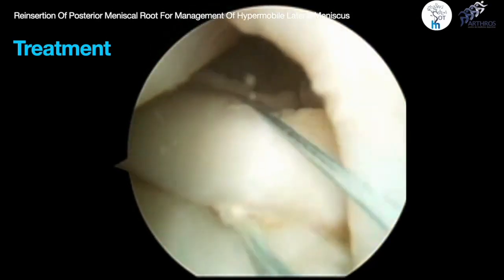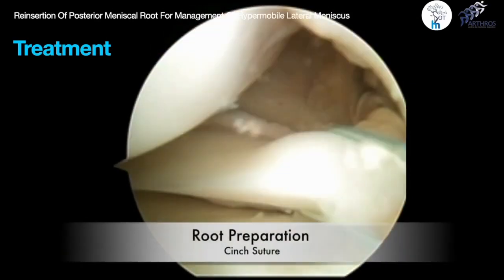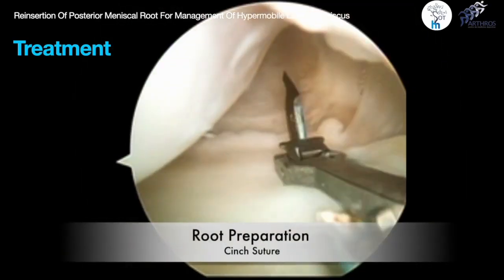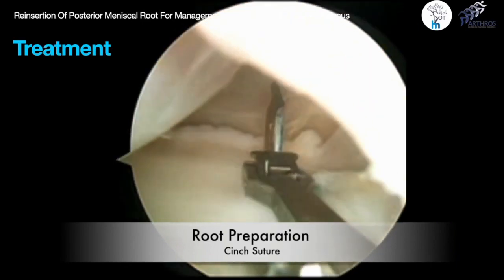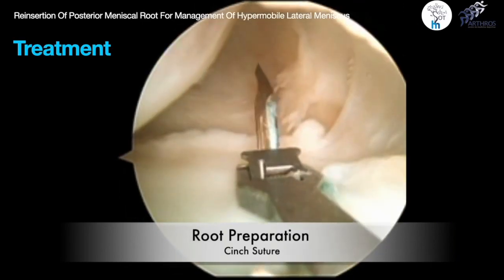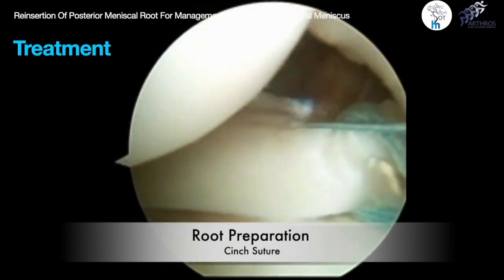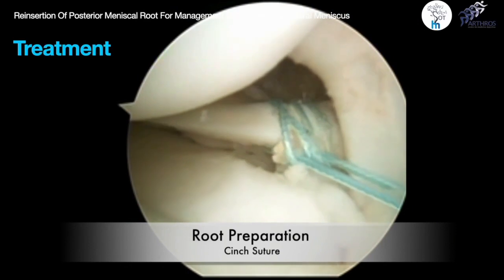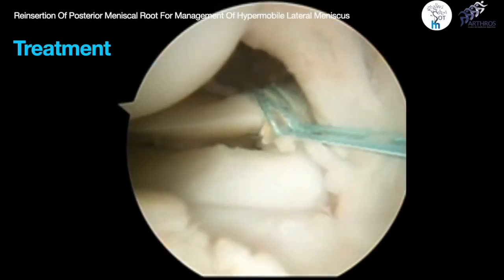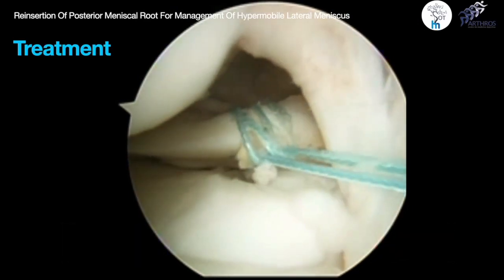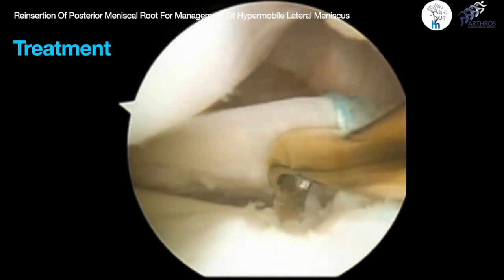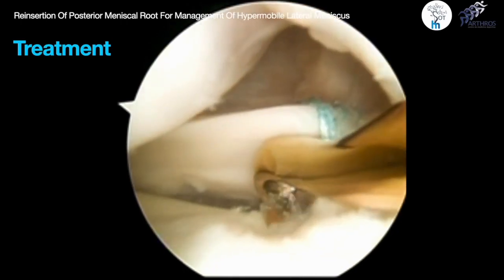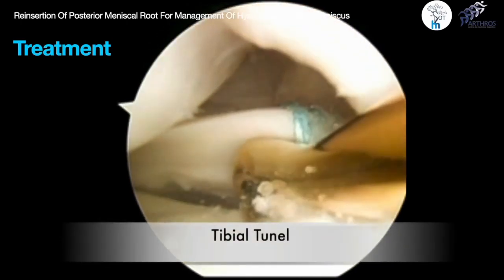The meniscal root is sutured with two high-resistance sutures and a scorpion-type suture passer. We used cinch-type knots to achieve secure suturing. For the tibial tunnel, we place the meniscal root guide at a 50-degree angle.